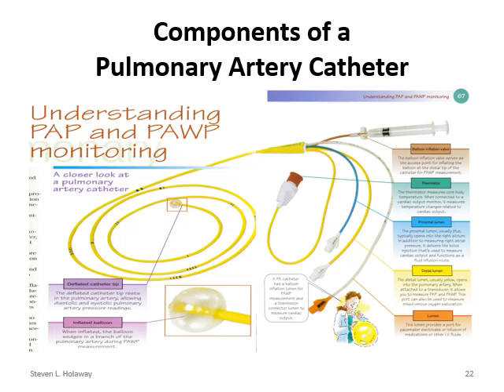The red port is only for air, and it has a specialized syringe that will only deliver 1.5 cc's of air into this device. One thing you don't do is ever change this syringe out and get just a regular syringe from your med room. This will only pull back to 1.5 and will only deliver 1.5.